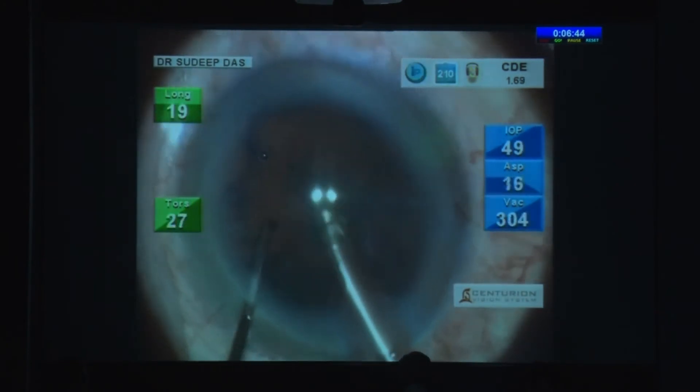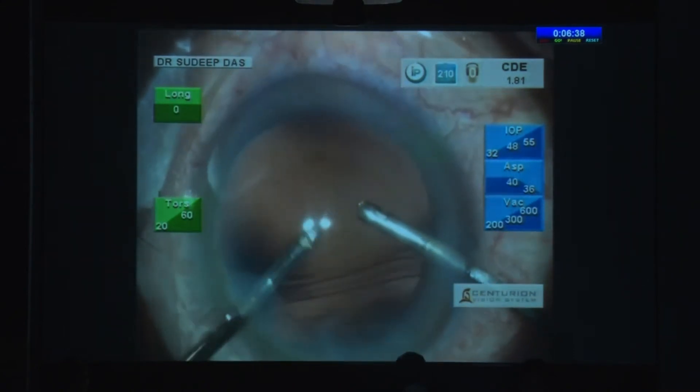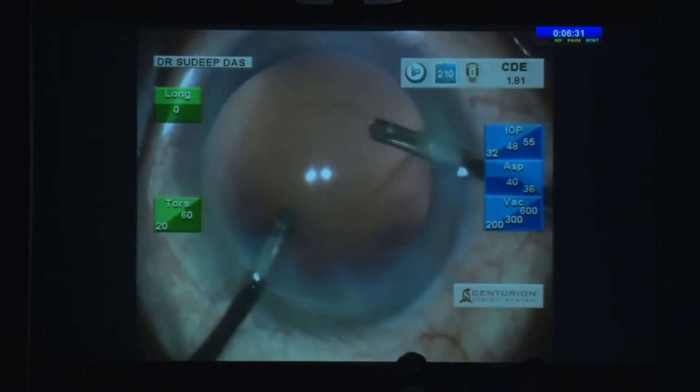Sometimes you think, okay, the opacity is so tiny, nothing's really going to happen. I actually finished everything — even my IA was over — and just for that little bit of posterior capsule opacification, decided to touch it. And there the PC is — there's a hole in the PC.